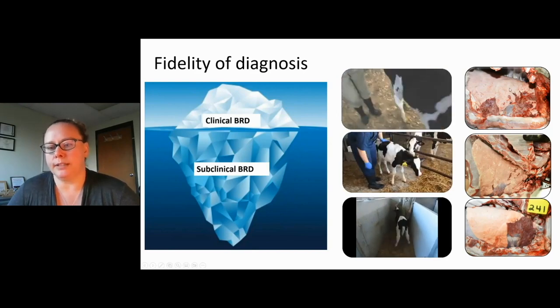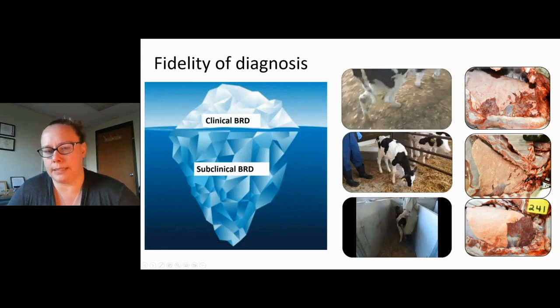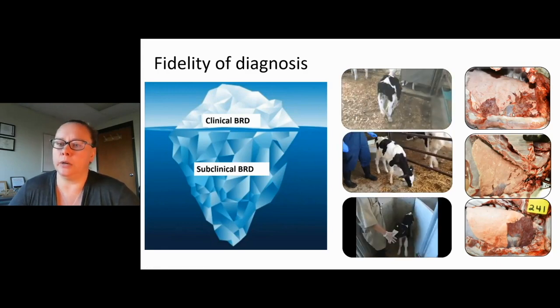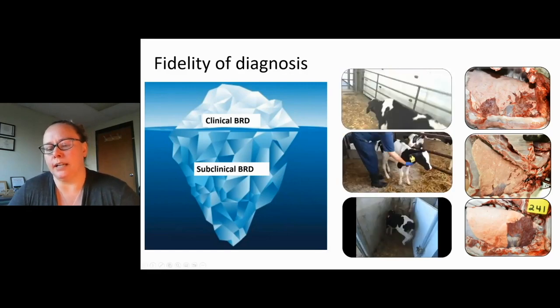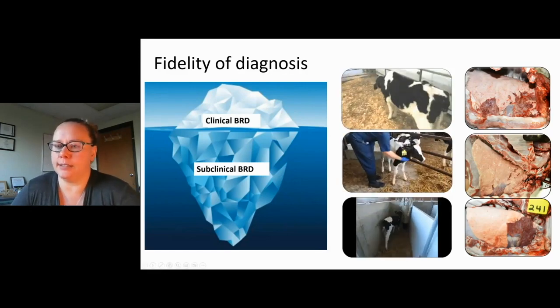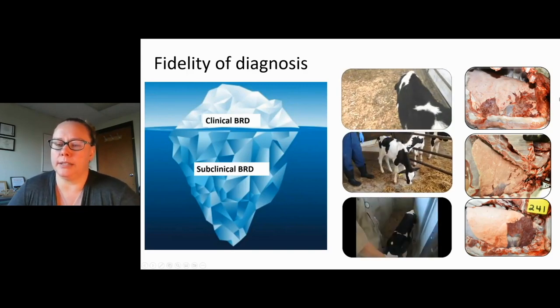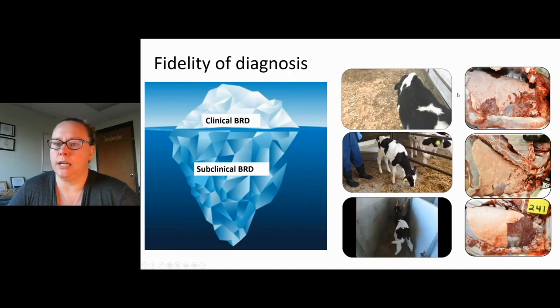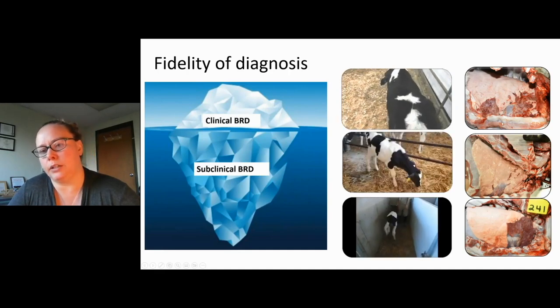And when we look over here on the right-hand side and we see the lungs of each of these calves taken from the same day that video was taken, I'll orient you just so you really know what you're looking at here. We're looking at the right lung where the calf is laying on their left side. So the head would be over here to the right of the image. The tail would be to the left of the image. The top of the picture would be like the spine, and then the bottom of the image is the sternum.